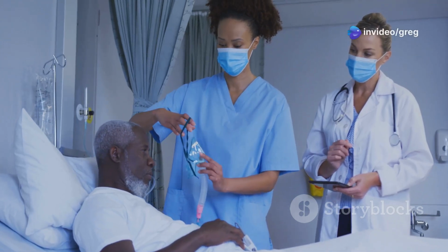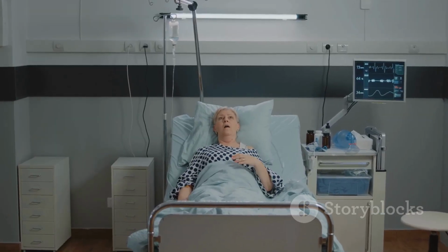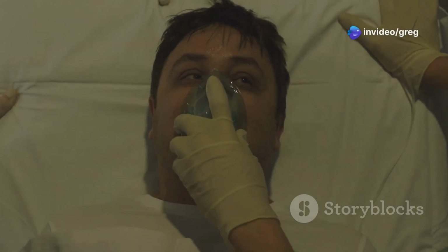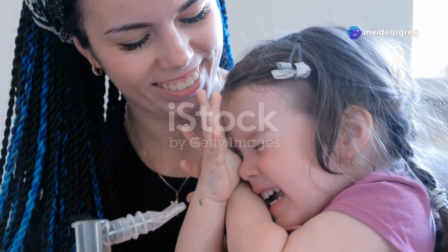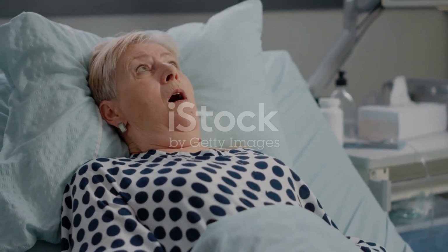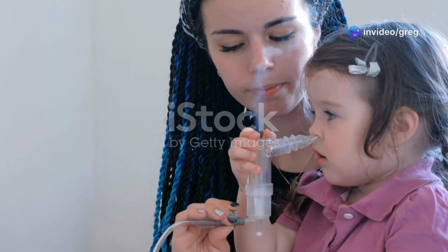Respiratory rate also plays a role in lung protection. A high respiratory rate can lead to air trapping and increased airway pressures, especially in patients with obstructive lung diseases. Adjusting the respiratory rate to maintain a normal arterial carbon dioxide level while minimizing airway pressures is essential. Inspiratory flow, the speed at which air is delivered during inhalation, can also impact lung pressures. High inspiratory flows can generate high peak pressures within the airways, potentially contributing to barotrauma. Lower inspiratory flows may be preferable to reduce peak pressures and minimize lung injury.